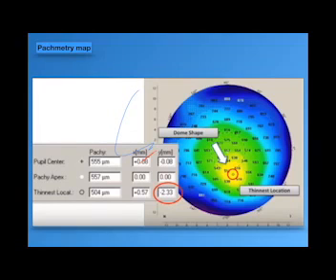Also, horizontal deviation may be expressed by scarring in the peripheral and mid-peripheral cornea. But the most important deviation is the vertical inferior deviation of more than -0.5. You will suspect more than -0.5 and don't do any surgery if more than -1.